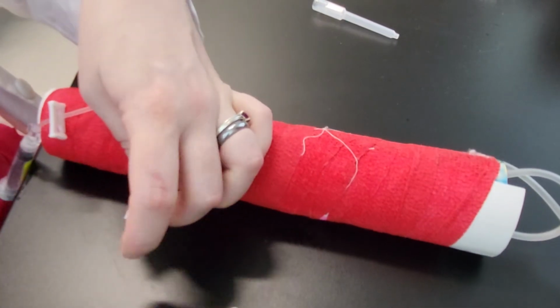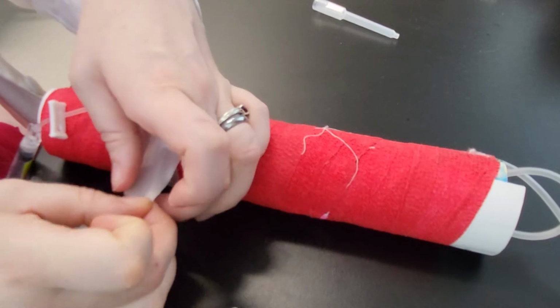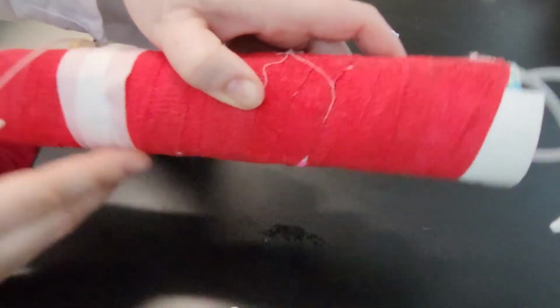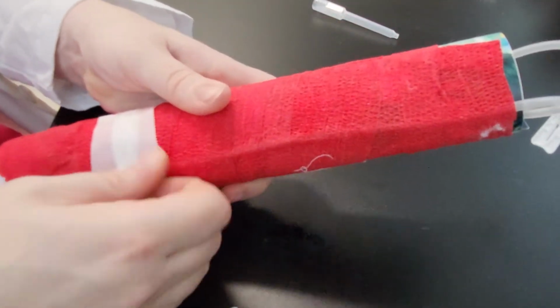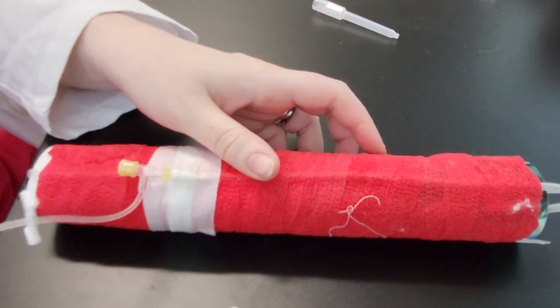So if your tape is too long, you can always rip off a little bit of it. No need to just wrap your patient with a million layers of tape. So this is your second piece of tape. This is how it should look. We pinch everything down, and you're good to go on that one.